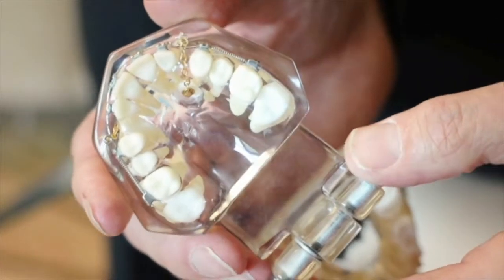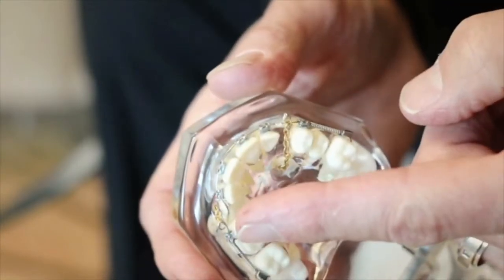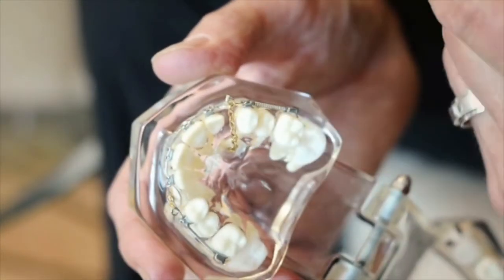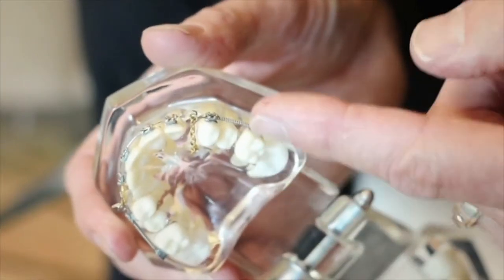Another example that we see is palatally impacted cuspids like this. Once you bring the crown into place it looks wonderful, but if the root has not come from the palate so that you create a canine eminence, then you're going to be in trouble because that's where it's going to jump back. Sometimes if you haven't created enough overbite, you will wind up having the crown jump back through the bite, which is pretty embarrassing.